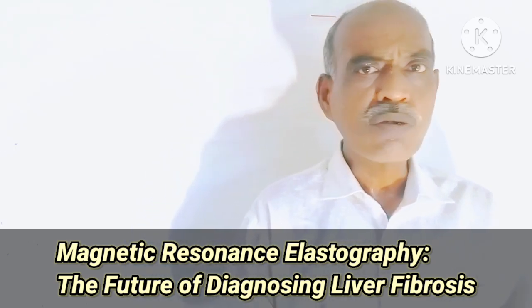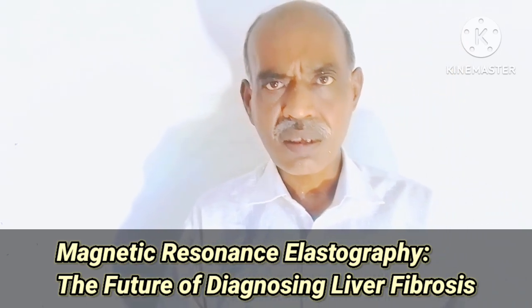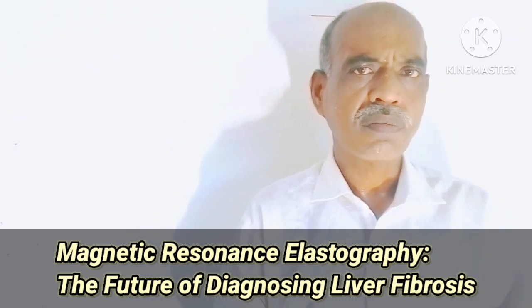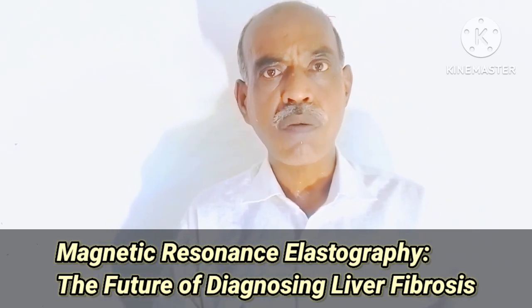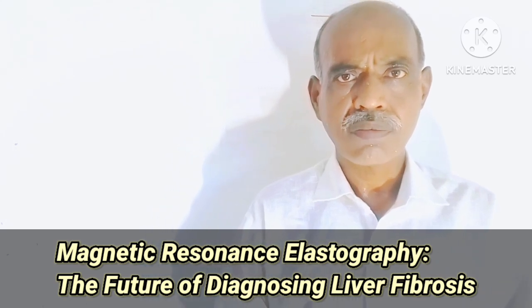Okay, so according to the stiffness we get this image. That means this elastogram provides us with the accurate result for liver fibrosis, because our requirement was to know the stiffness of liver tissues, the perfect location of the stiff tissues. That was the prime target.